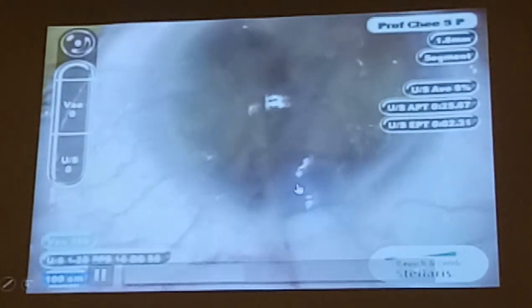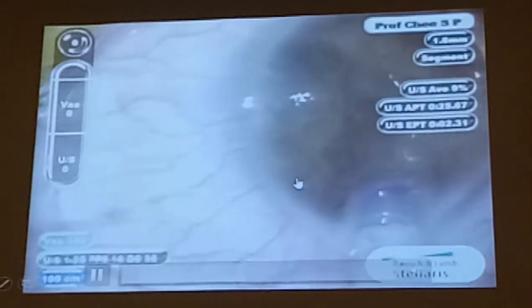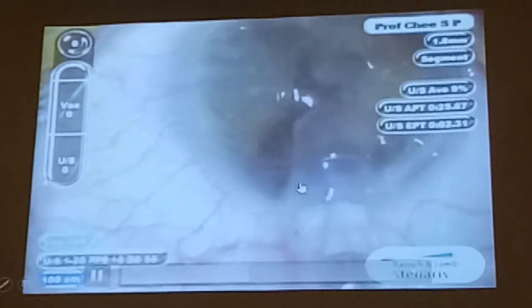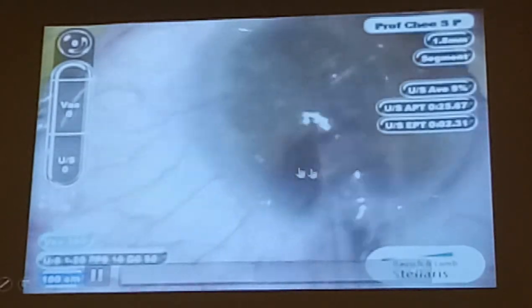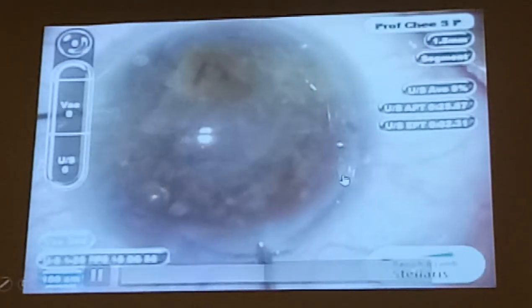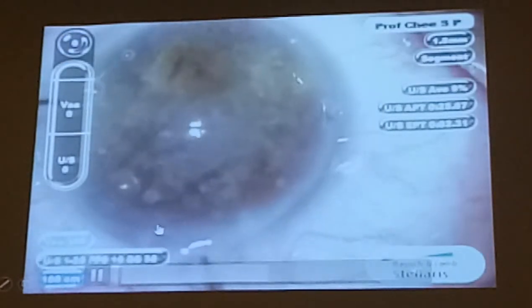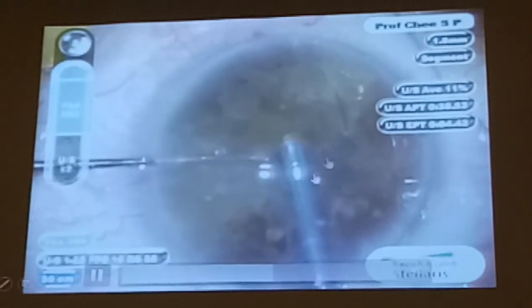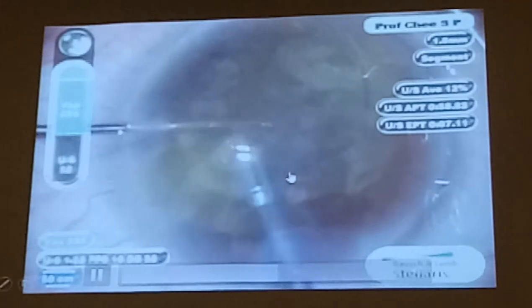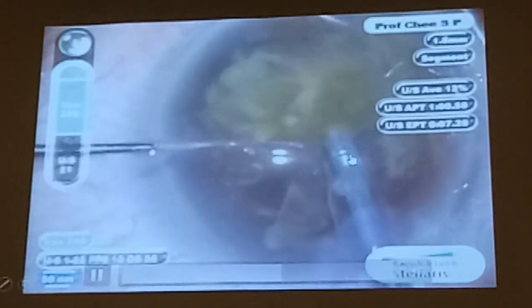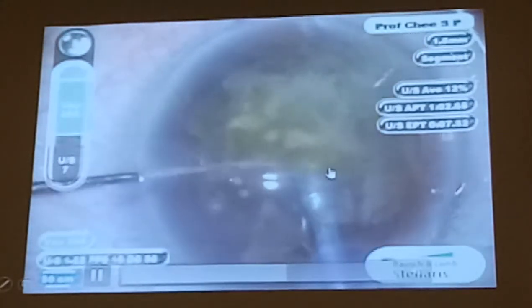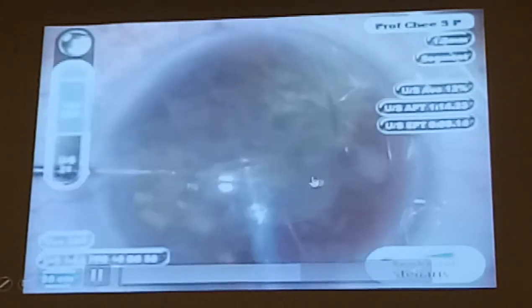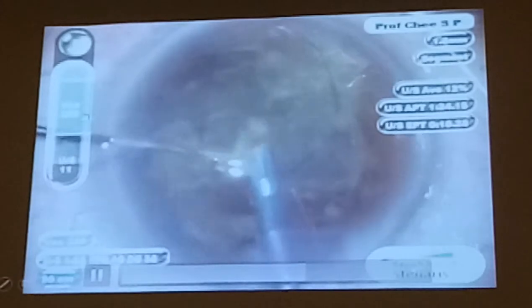Unfortunately, it's been fragmented into eight pieces so I can actually halve it in the center. I don't put in my IOL yet — I planned for a toric lens but no way. So the lens is going in somewhere. It's a big, moderately dense nucleus. I'm glad that these haptics are blue — because I can see the blue haptics. If I can see the blue haptics, it's not dropped through. So that assures you that it's not gone through the PC opening. Because when you inject the IOL, you really cannot see very well. So I had an enlarged incision — this was a 1.8 phaco — so I have to be very careful, with my vacuum on the low side.